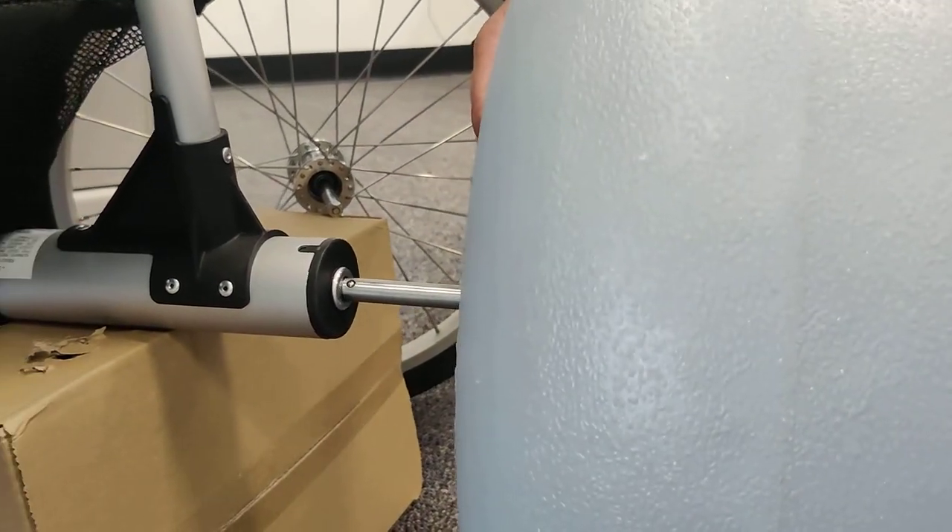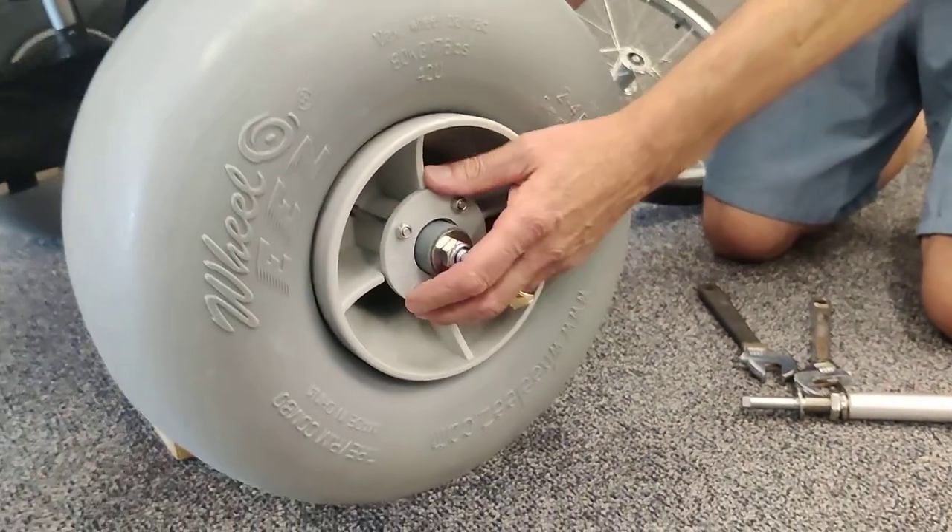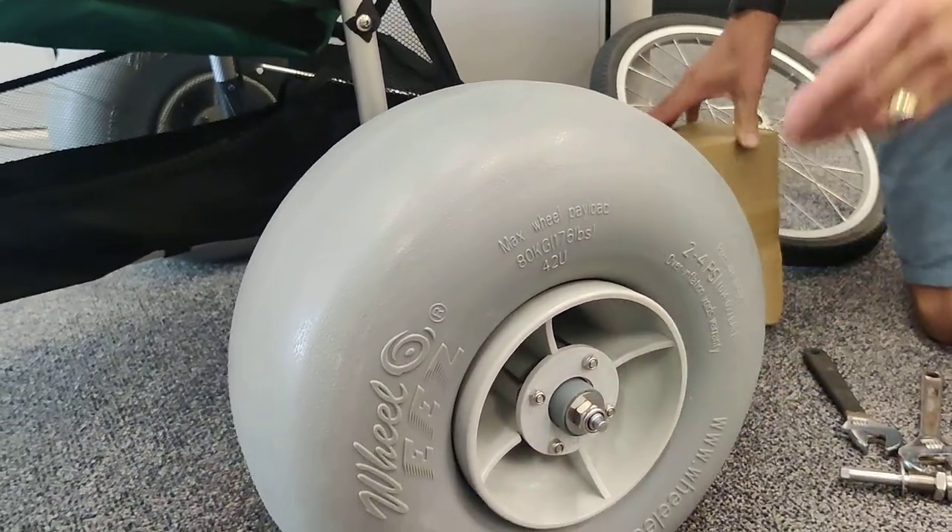Just push this on like that, slide it in and listen for the click. And that's really all there is to it. You're ready to roll.